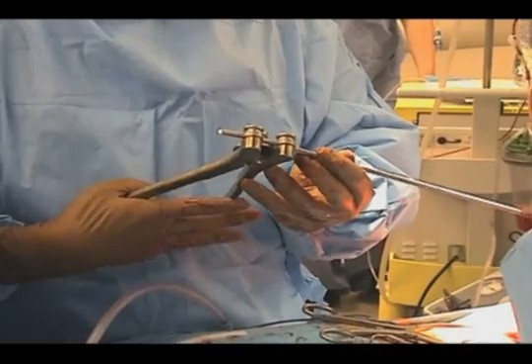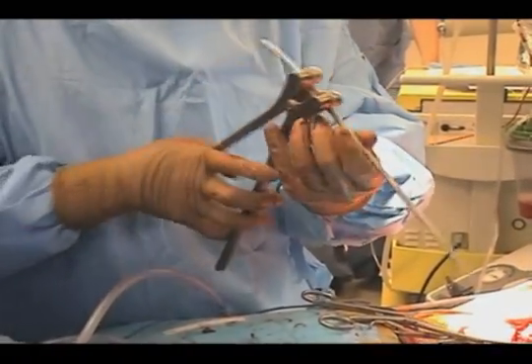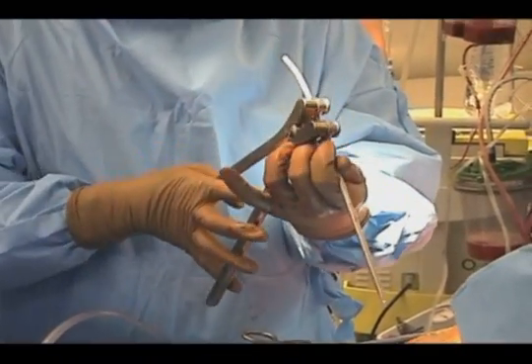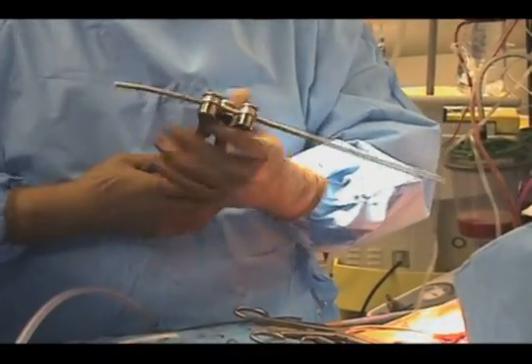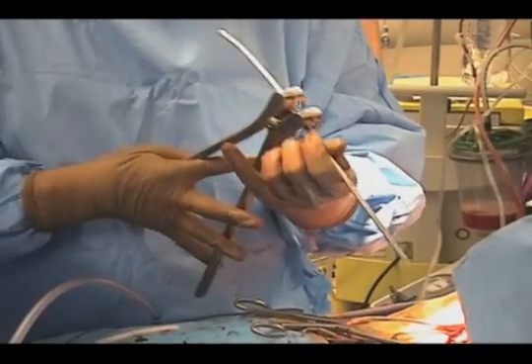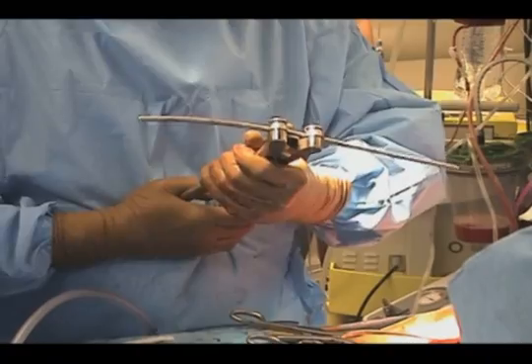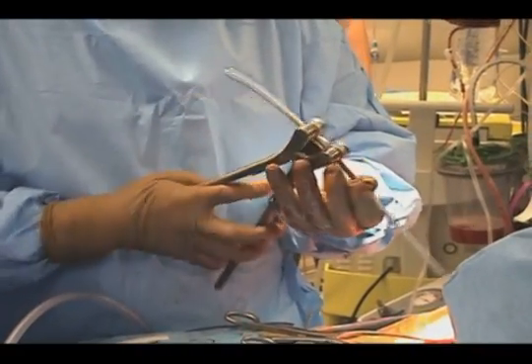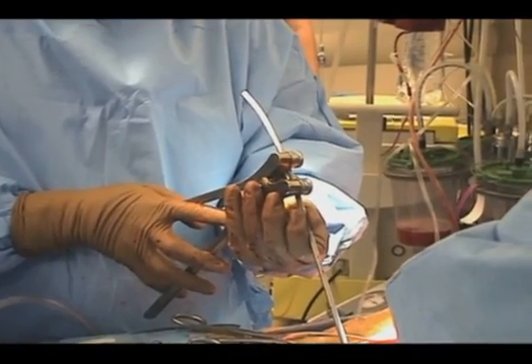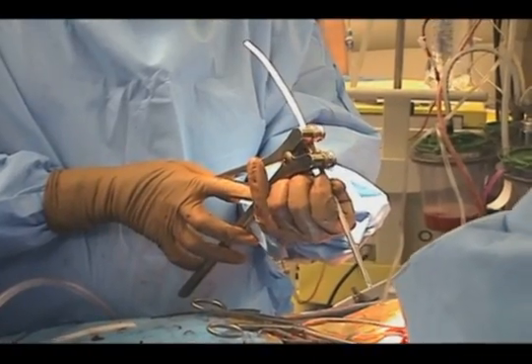Here I am cutting and then contouring the first rod, which is the concave rod. I use cobalt chrome, which has a greater strength and stiffness than titanium and then standard stainless steel. So this allows us to really obtain and then hold correction within rigid deformity. And the key is to over contour the concave rod to really pull the hypokyphosis into a more kyphotic configuration. We really want to match that to the patient's innate anatomy.